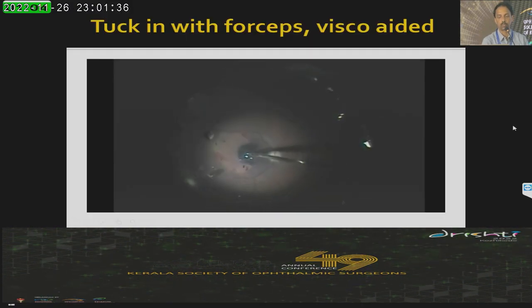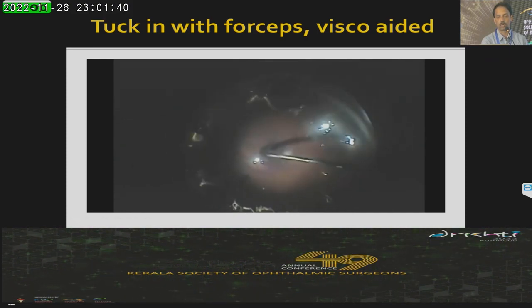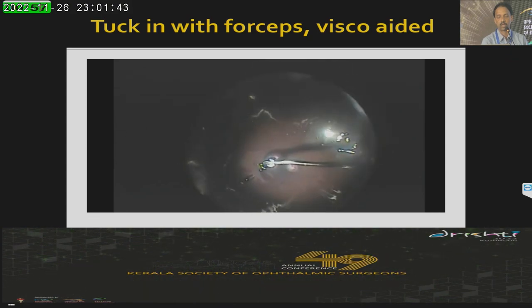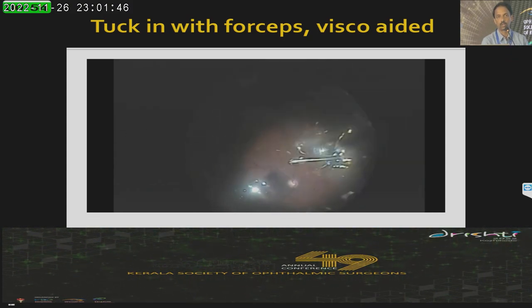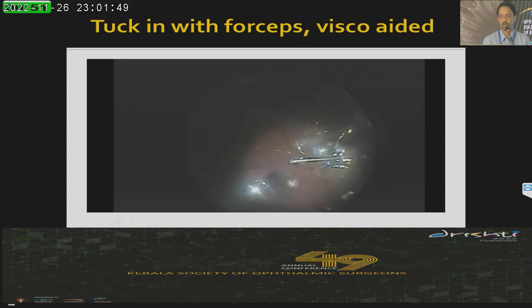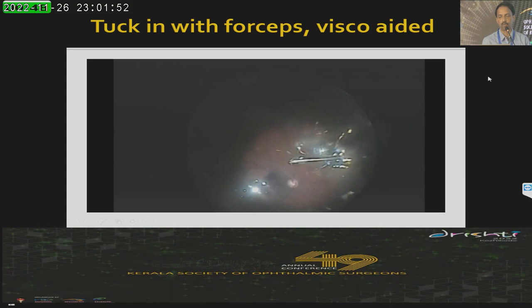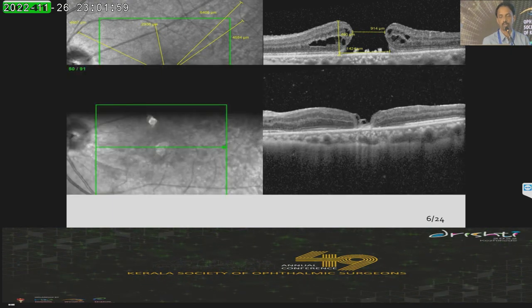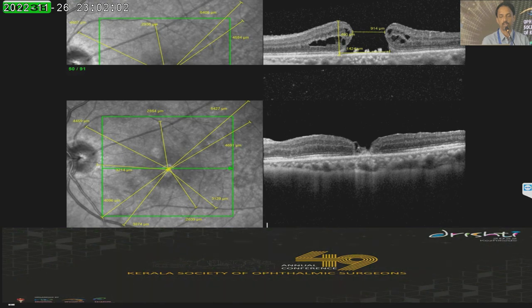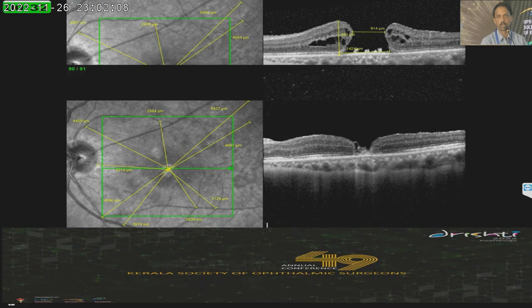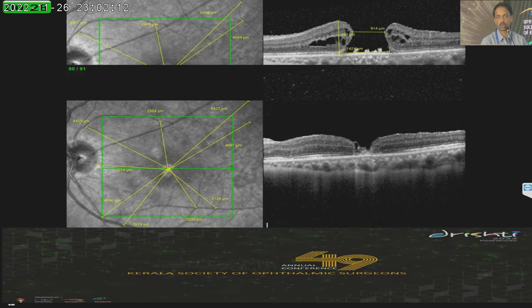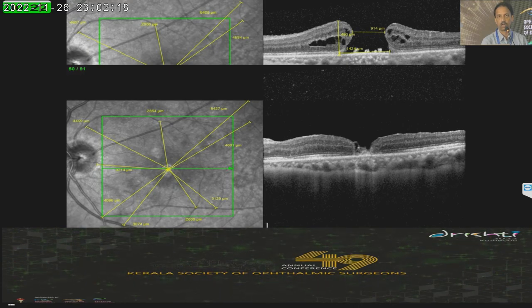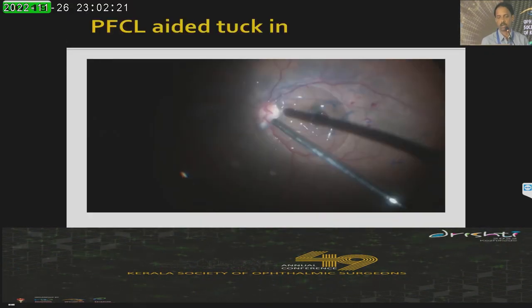This is a tuck-in using a forceps — sometimes I like to do it under air because the flaps are more easily mobilized. I sometimes put a drop of viscoelastic so that the flaps are maintained there. Though visualization is slightly difficult under air, you can do it. For a 1424-micron hole, this shows type 1 closure. In our analysis, the temporal portion of the hole shifts more than the nasal portion, so it would be nice to peel more temporally than nasally to allow easy movement and shift of the retina to close the holes. You could also use PFCL, which keeps the flaps in place and visualization is also better.